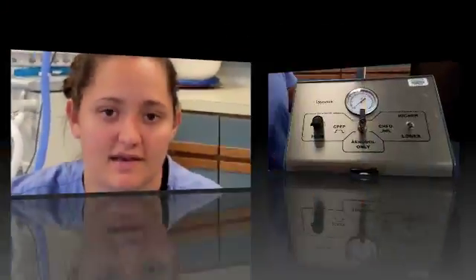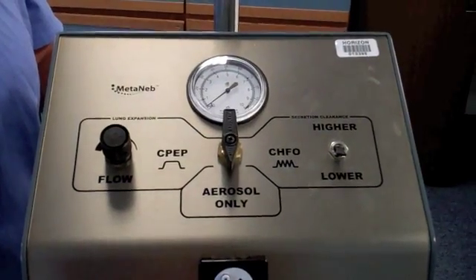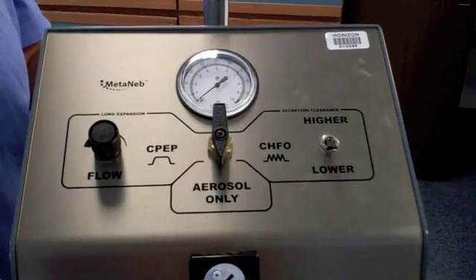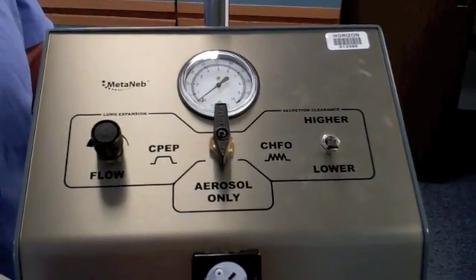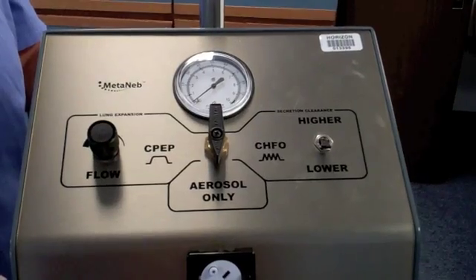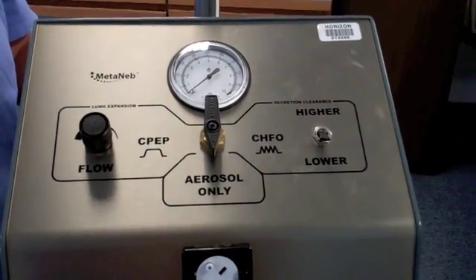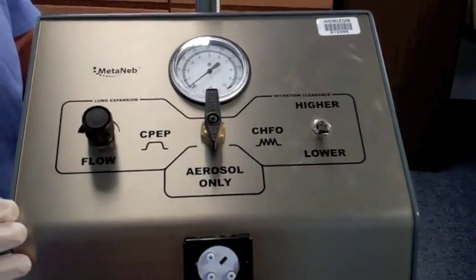Today we're going to show you how to give a patient a treatment via Medanib. The Medanib has three different ways in which it can help treat the patient, or three different modes. The first mode, with the arrow pointed down, is the aerosol mode. This is used to administer aerosol medications.